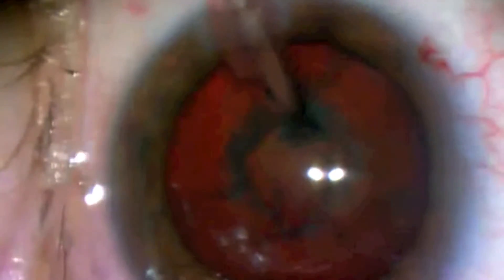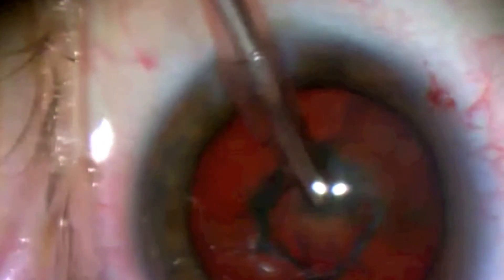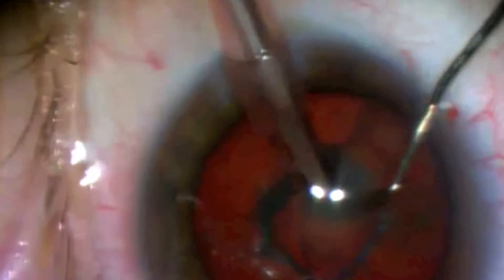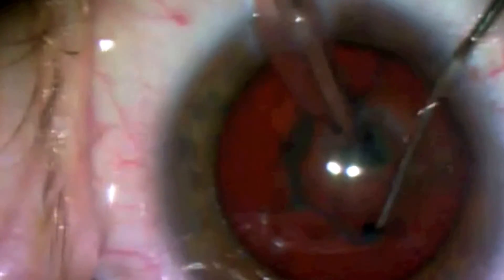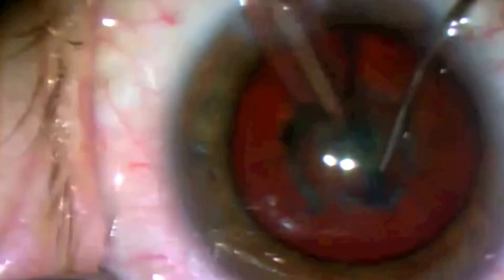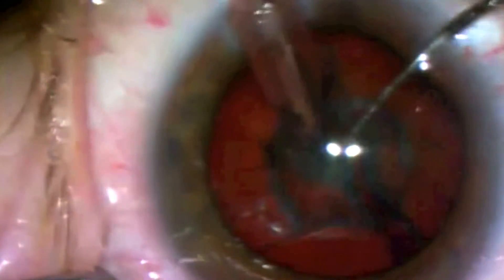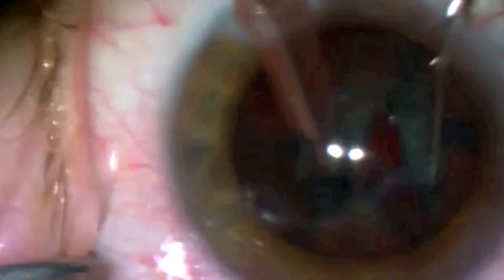Here's one more softer case. Again we're preparing the nucleus by clearing everything out and making our little tunnel. Once we have our tunnel, we'll add the chopper into the eye and then place the phaco tip back into that previously created tunnel, go onto the vacuum, and again just slowly push the chopper into this nucleus. Once it's deep, you can then separate the pieces and you can see how nicely and quickly that separates. We'll then spear the remaining nucleus and just keep going around, separating the pieces as you spear it.